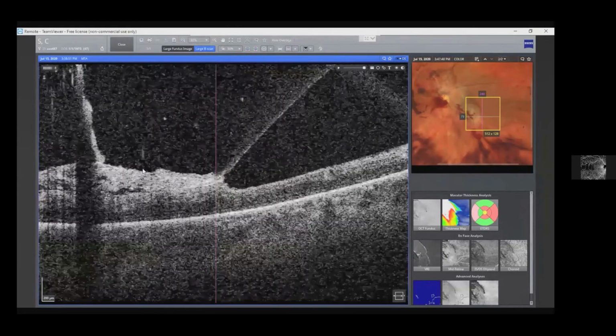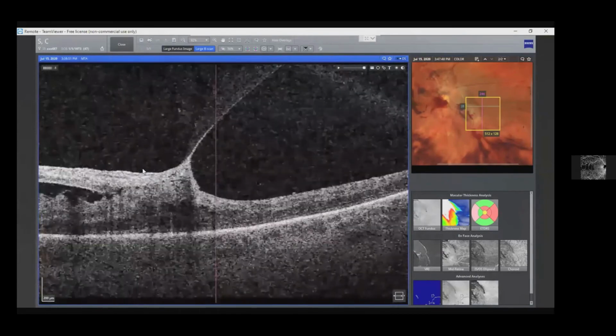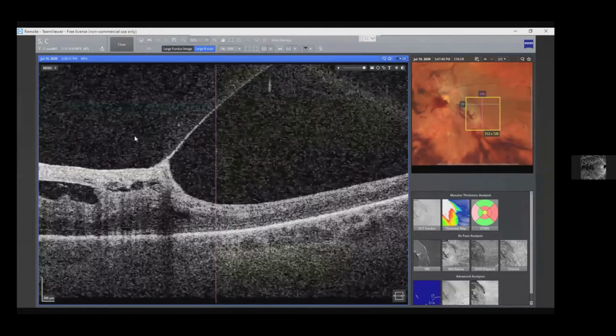And so this is a nice way to establish where the hyaloid is elevated. Also, if we scroll superiorly, we see areas where you can start to undermine this fibrotic tissue. See, there's a surgical plane there. A great way to start your delamination and remove this area of traction. So again, a nice way for surgical planning.